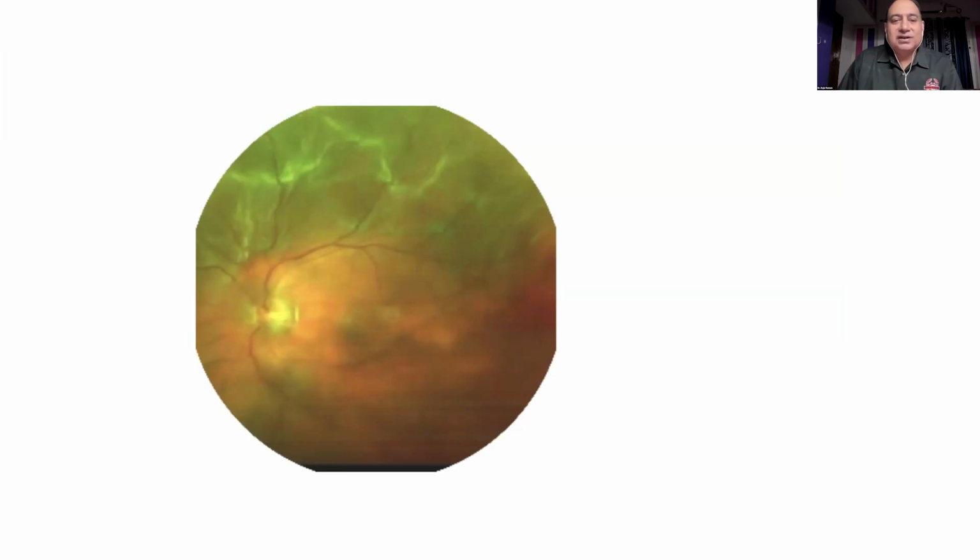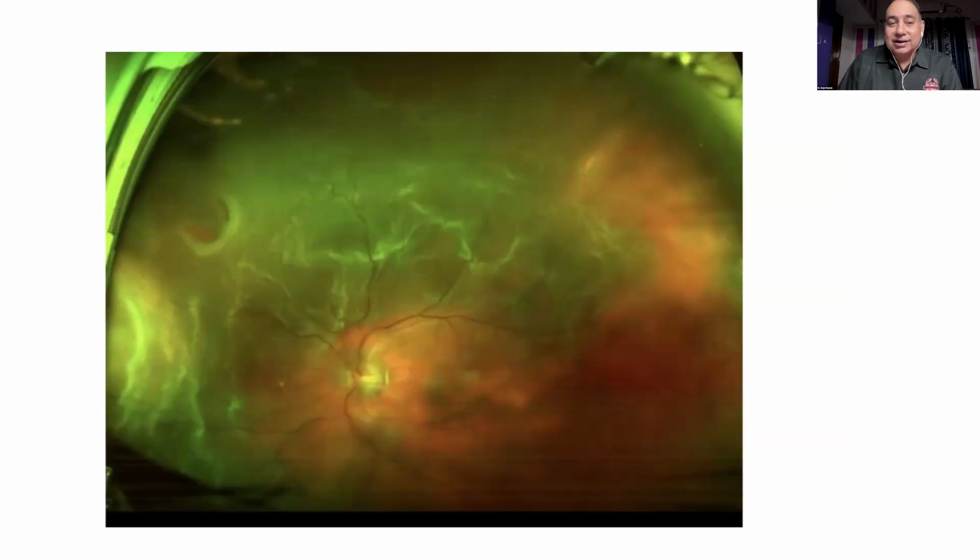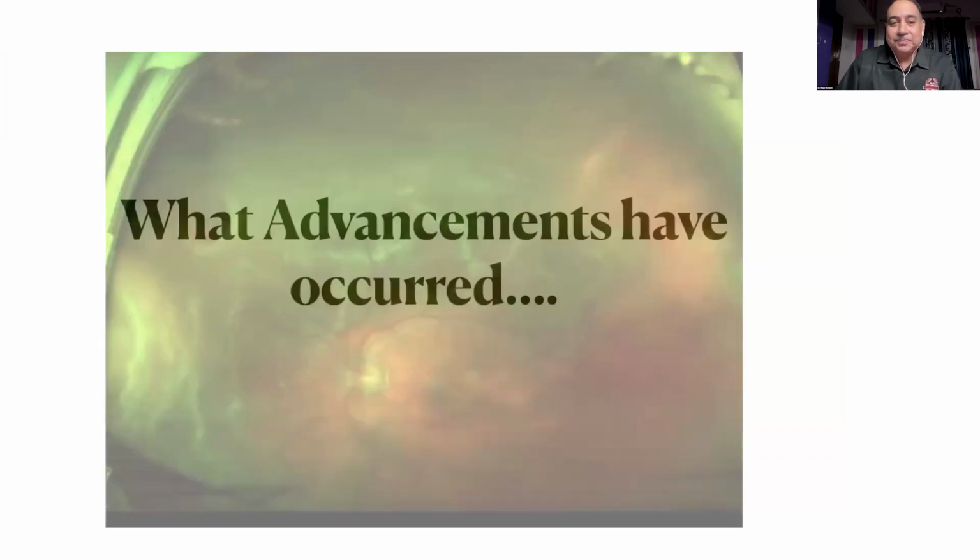You take a wide field, definitely you can say now the upper part of the retina is detached. And with the ultra wide field, you can even see the lesions which have caused these detachments. On the upper right, you have a small tear and a horseshoe tear in the upper nasal quadrant. So ultra wide field imaging definitely can pick up these lesions. It can identify what caused this rhegmatogenous retinal detachment.